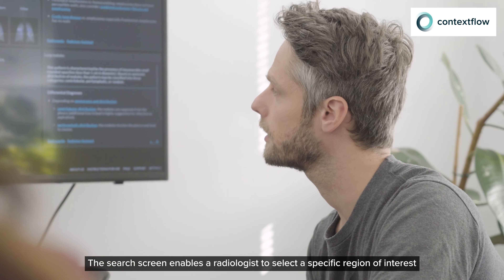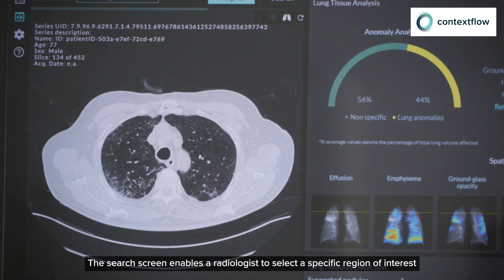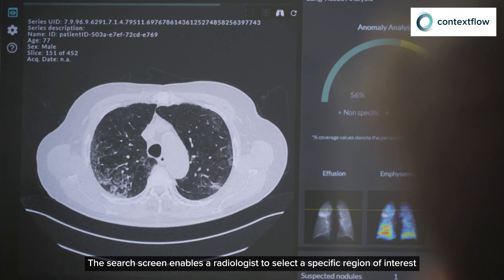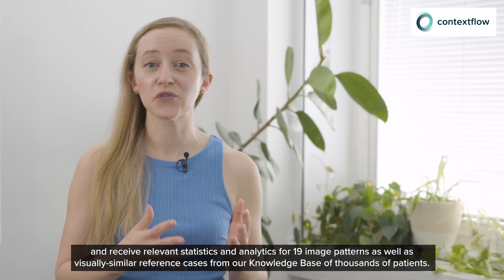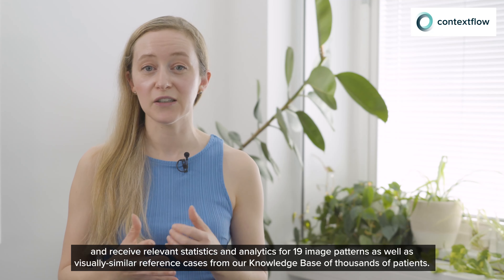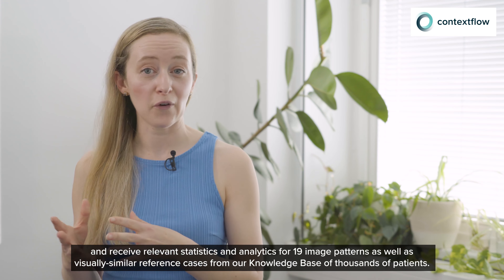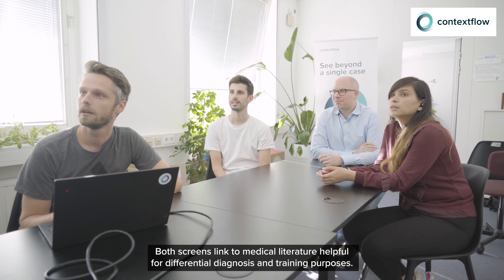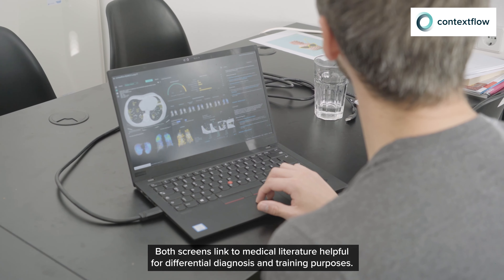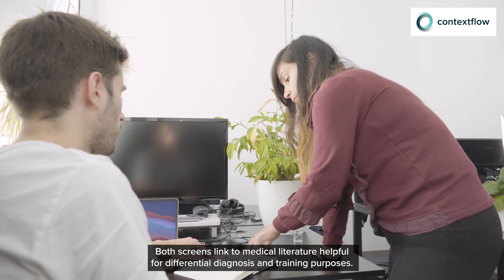The Search screen enables a radiologist to select a specific region of interest and receive relevant statistics and analytics for 19 different patterns, as well as visually similar reference cases from our knowledge base of thousands of patients. Both screens link to medical literature helpful for differential diagnosis and training purposes.